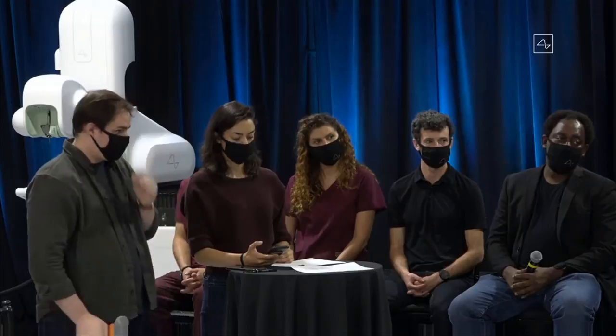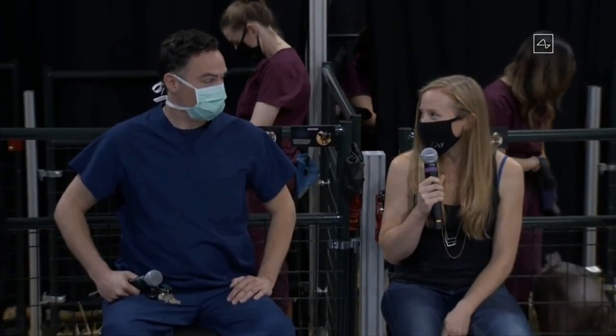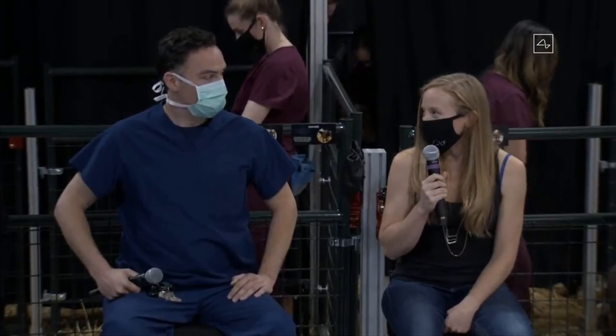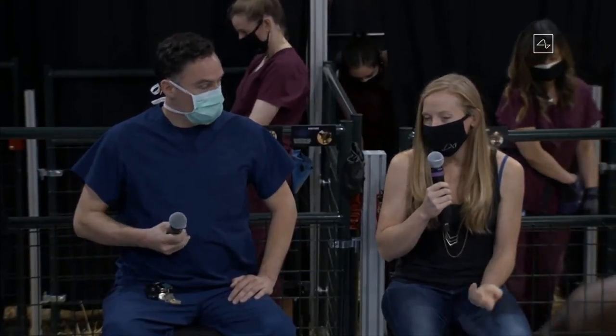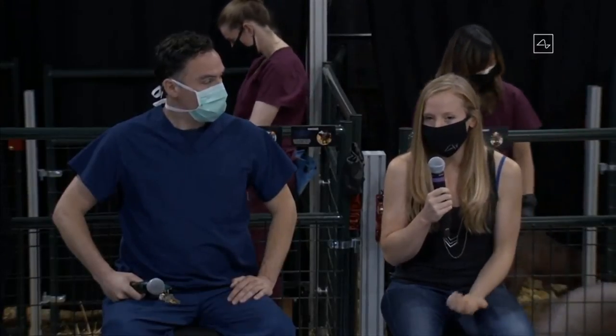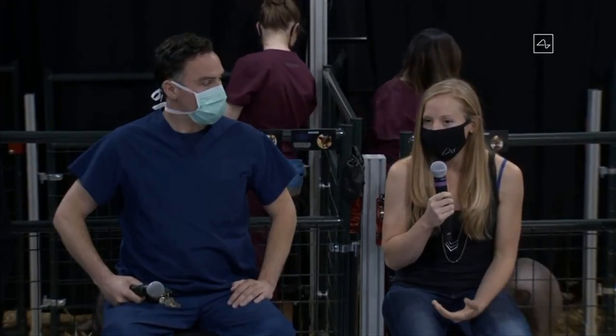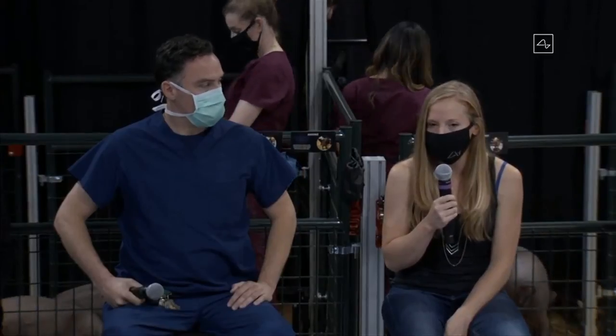Sure. Well, I think Matt's probably replaced a lot of pieces of skull with plastic and other materials, so I don't know if you can talk about some of those. But basically, we know what the mechanical properties of bone are, and we know what the stresses on the device are going to be. So it's fairly easy to just go from first principles and design for any condition that it might see.